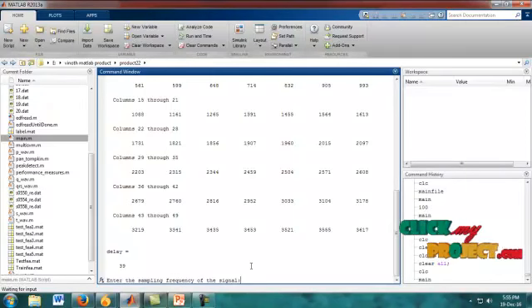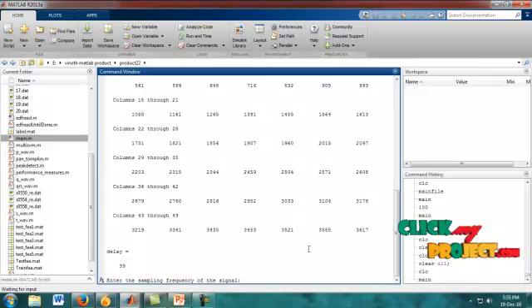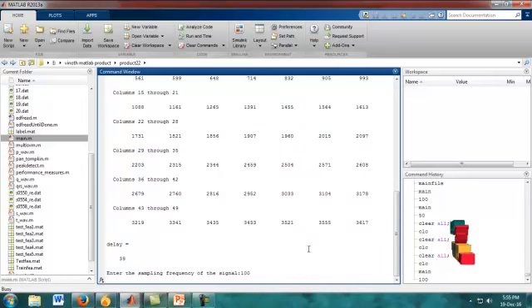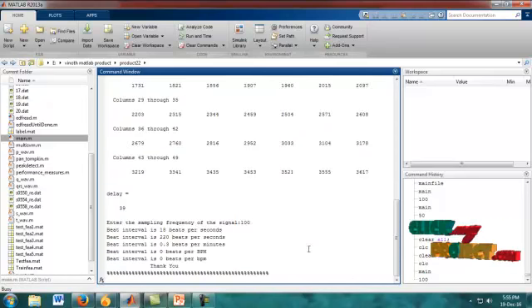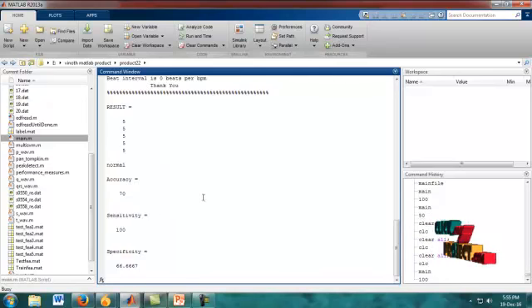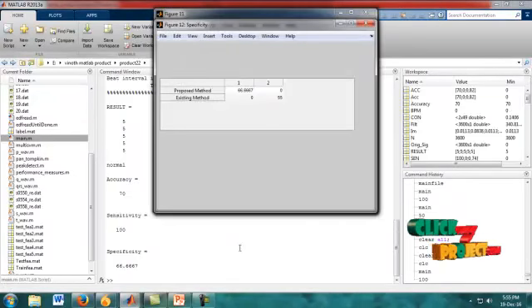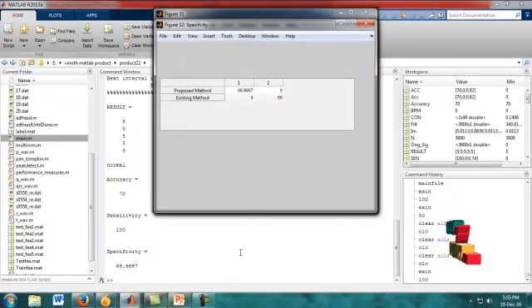In the command window, it shows 'enter the sampling frequency of the signal.' We provide the sampling frequency, for example 100. According to the frequency value, the result will be shown in the command window, which is the overall result of our process.